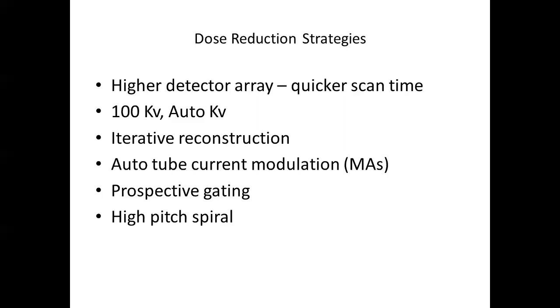And this is where there's something called a pitch for a coronary CT, and it depends on how quickly the table moves. Technology has improved to the point that the table moves quick and the gantry moves quick, so you can actually scan the heart in one heartbeat. And of course, you're going to have much less radiation with that. Usually with high pitch spiral, and we'll talk about that, everybody can't be scanned in that. A lot of things have to be in place for this to work. The doses are less than 1 millisievert, which is really low dose.